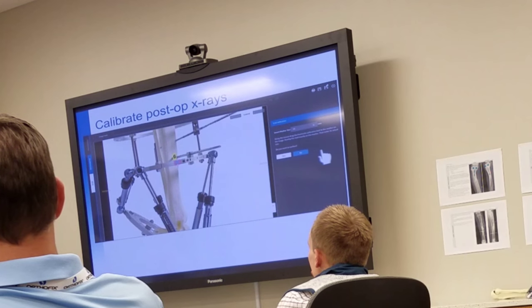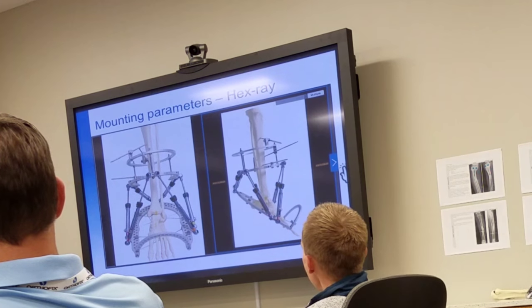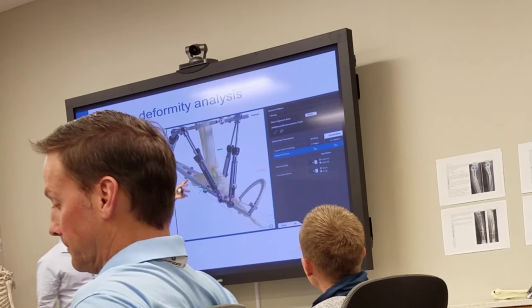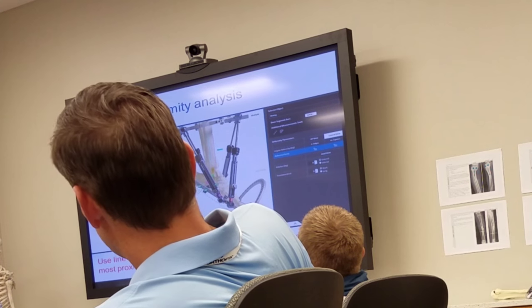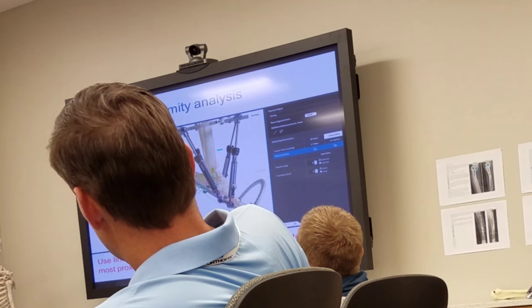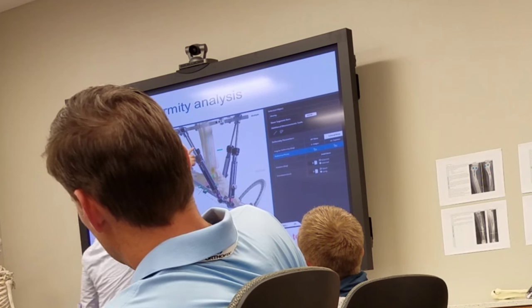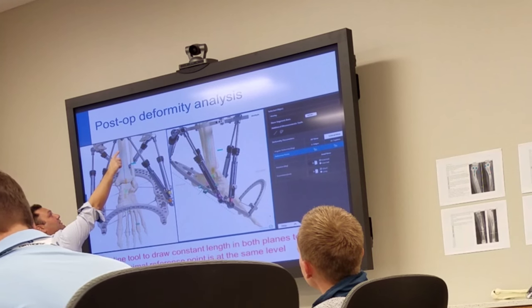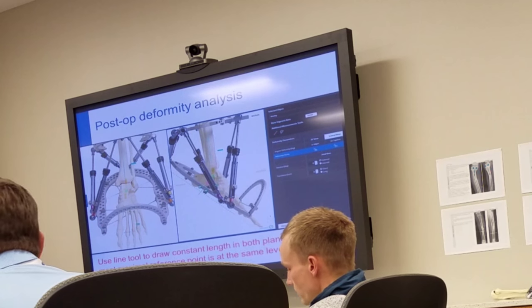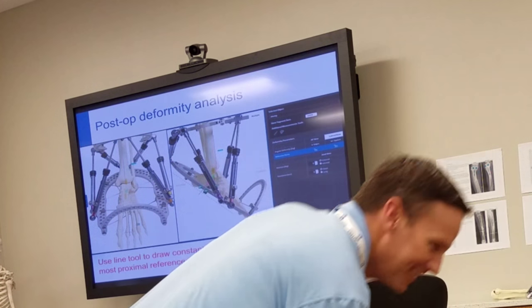Now we're going to do our mounting parameters side by side. We have our proximal portion, distal portion, and proximal distance. You can use this reference line so you know where you are. Use the line tool to draw a constant-length line in both planes, because you have to make sure you're in the same spot in both planes. The point is, we know where the tip of the ankle is, but we need to make sure this upper point of the line is in the same spot in both views. Mark off on the tibia for the model.